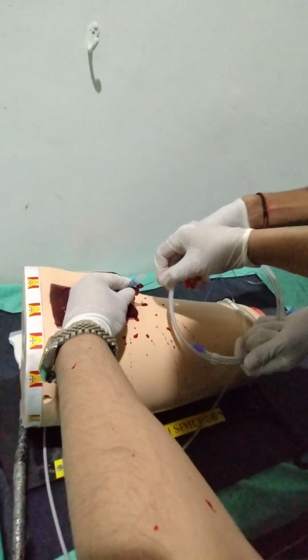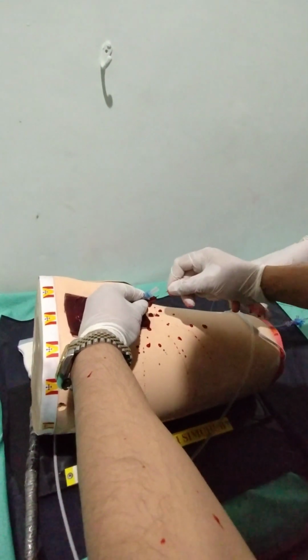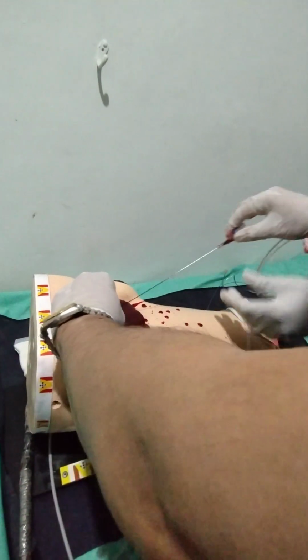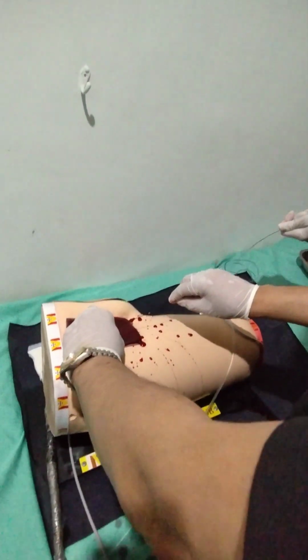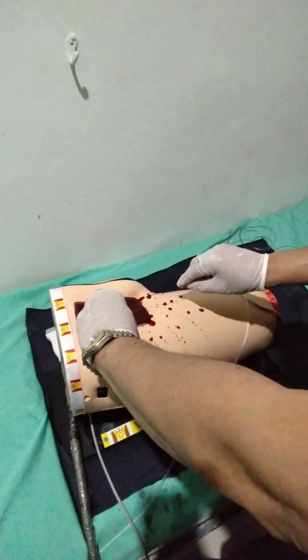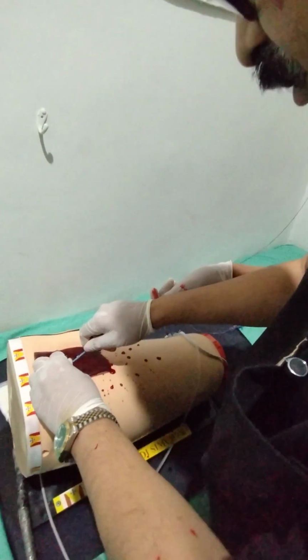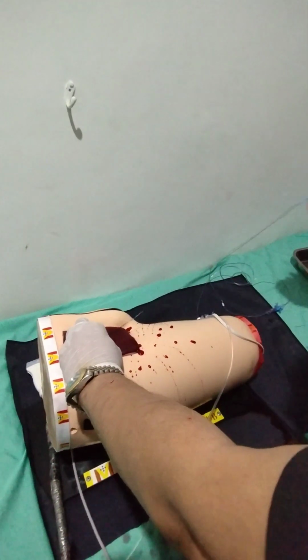So we want these kinds of simulations. Remove the needle and stabilize the guide wire. Now pass the first dilator. Stabilize the guide wire. So dilate, and then thread the catheter.